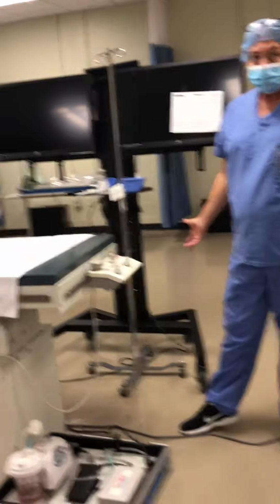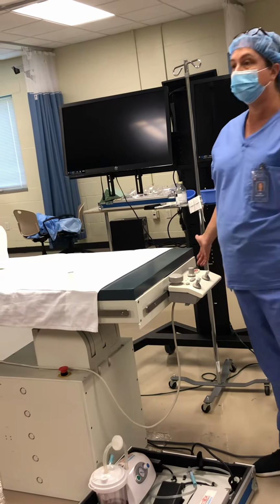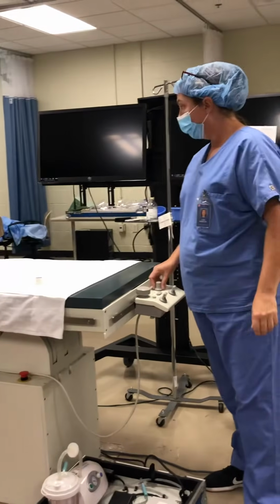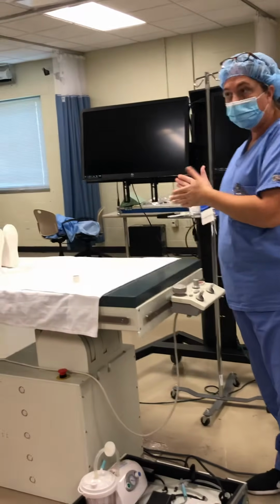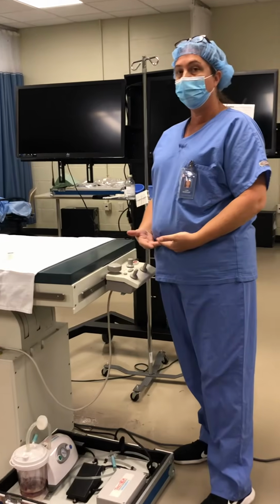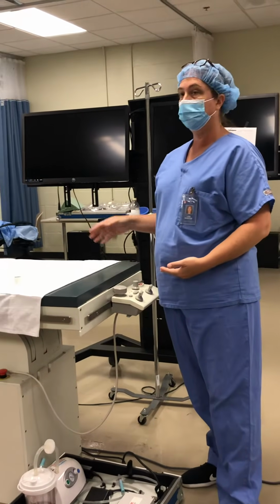So that's 3 views, should be pretty simple. Right renal, LAO, 15 to 30. Shift your patient over a little bit, be at that renal level, have the renal artery in the center.